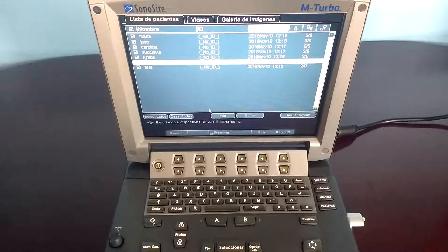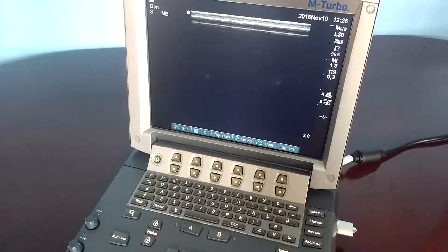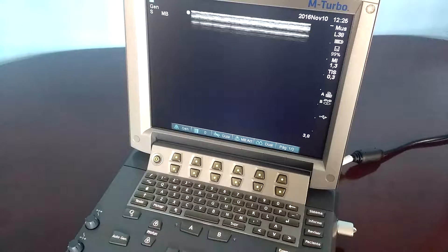The image exportation will begin, but you can keep scanning. It's important to not unplug the USB stick while the USB icon is blinking.